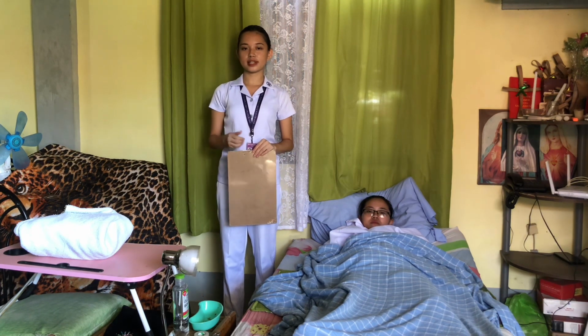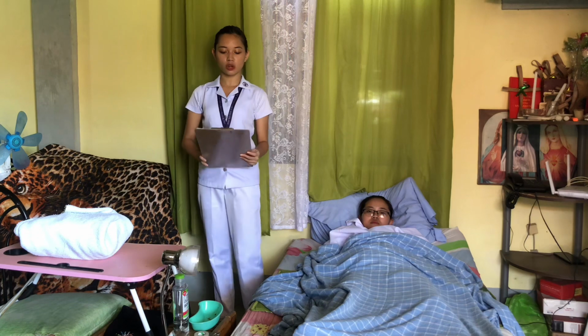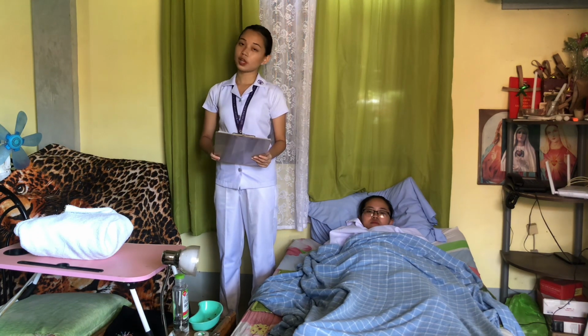Catheterization reduces the risk of infection and kidney damage by making sure that the bladder is empty, either continuously or at regular intervals. So prior to the conduction of the procedure, we have to check the doctor's order for catheterization. This is to ensure that we have the right patient and right procedure to be done.